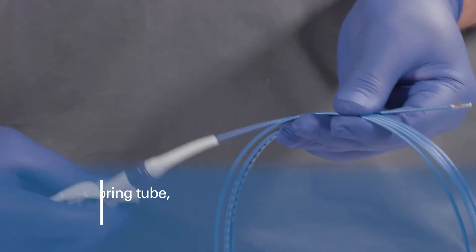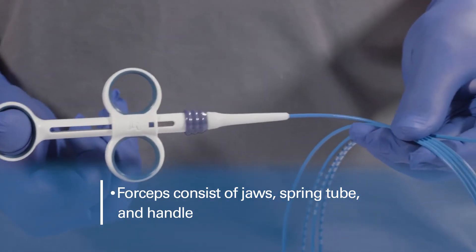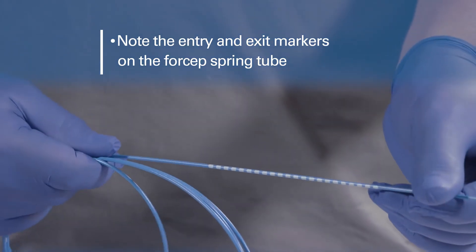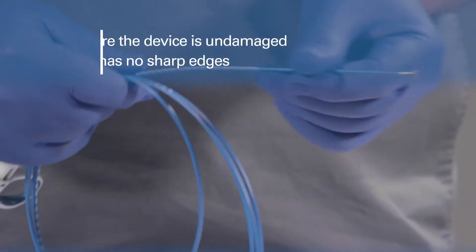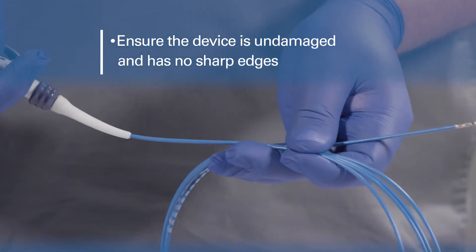The forceps consist of jaws, a spring tube, and a handle. Note the entry and exit markers on the forceps spring tube. Prior to use, ensure that the device is undamaged and the jaws and spring tube have no sharp edges.